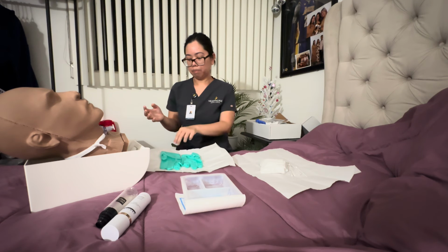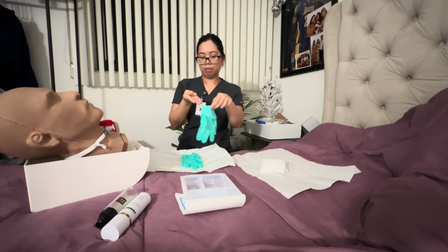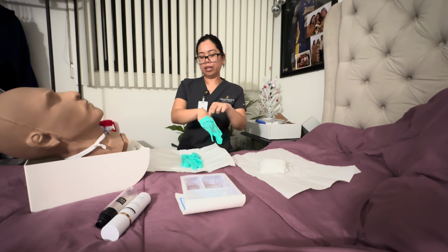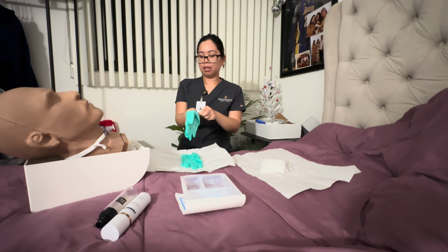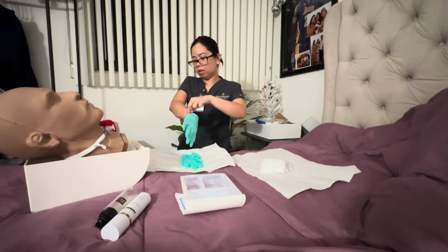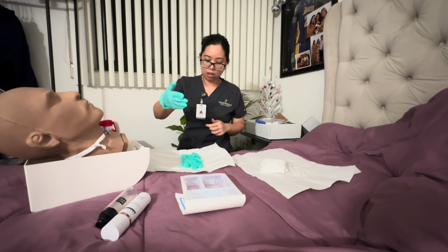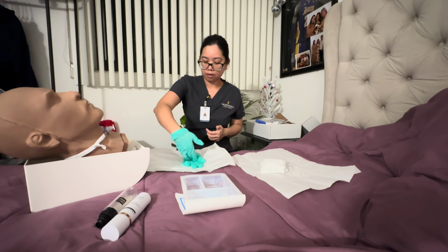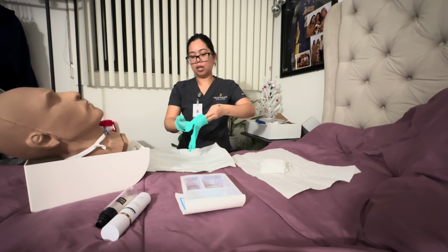Okay, I'm gonna go ahead and pick it up, and then I'm gonna put my hand in and slide. I like to pull from the back because sometimes the gloves roll on me. Okay, so once you have your gloves, you gotta get the other side. You gotta pick it up from under the cuff, and then insert your hand.